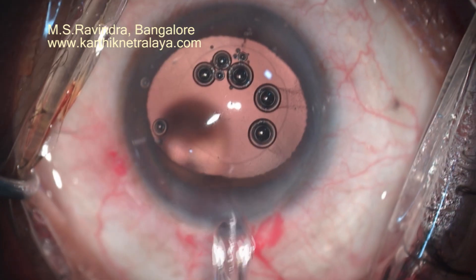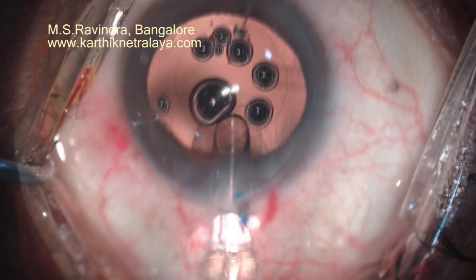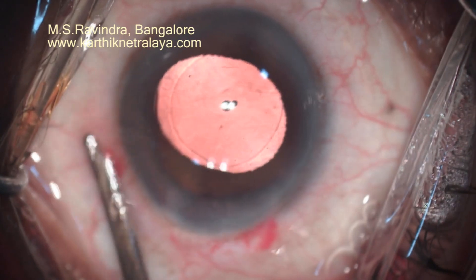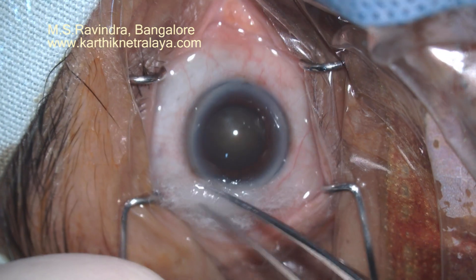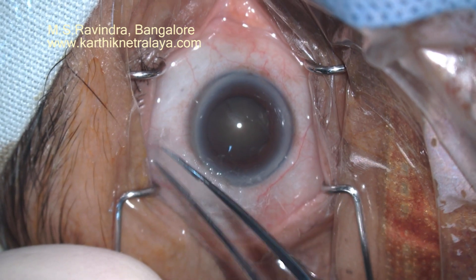Many times a shallow chamber helps you, and many times a deep chamber helps you. This can be controlled by visual feedback by balancing the amount of aspiration you are going to do with the syringe and the amount of fluid injected into the eye. The total amount of BSS needed is about 20 to 30 milliliters in this technique.